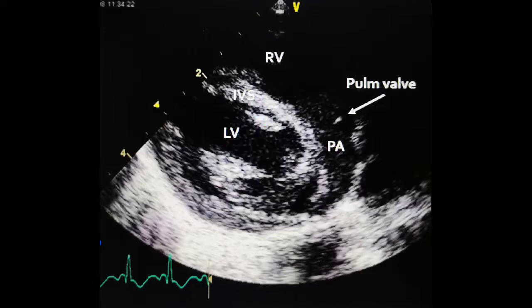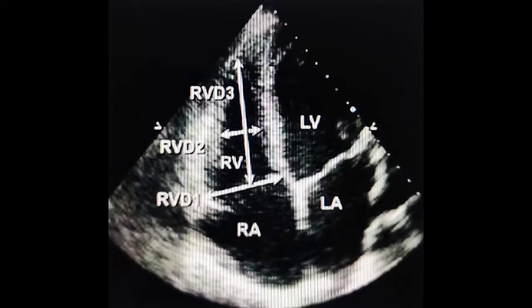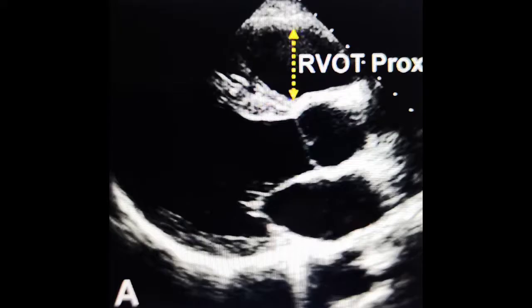In pulmonary hypertension, you will see a crescent shape of the RV and septal flattening during systole and diastole. In the apical four-chamber view, RV hypertrophy and dilatation are present; the RV free wall is the first to become hypertrophic, with systolic dysfunction and low tissue myocardial velocity. RV wall thickness will be more than 5 mm. At the base, RV diameter will be more than 42 mm, at mid-level more than 35 mm, and longitudinally more than 86 mm.